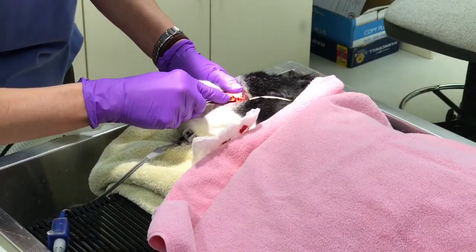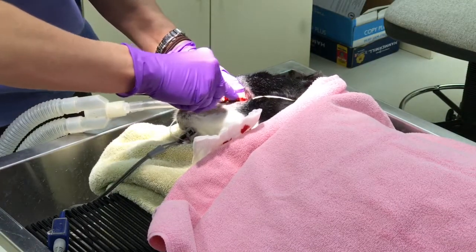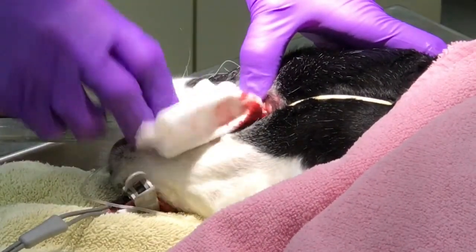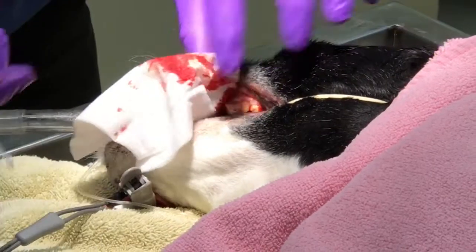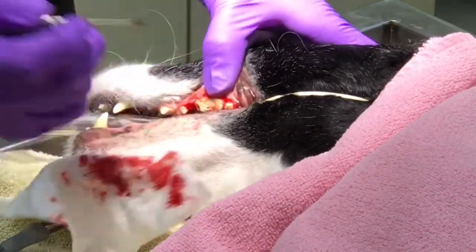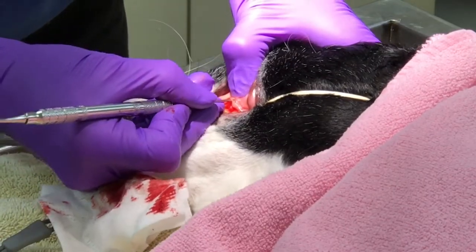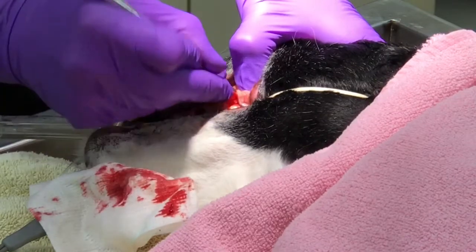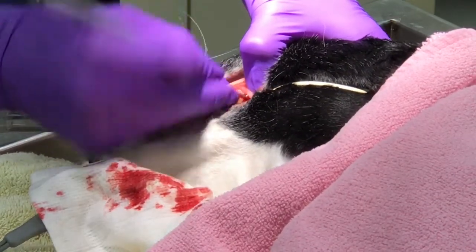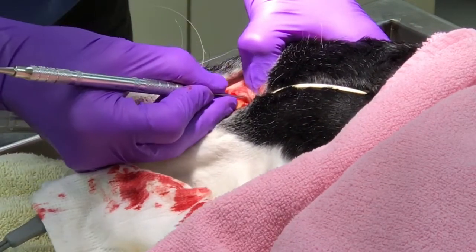Alright, so now we're going to try to elevate the flap. And since we are dealing with an oral cavity, it's considered a contaminated area, so sterility is something that cannot really be achieved in these circumstances. So we're going to simply make a gum flap so that we can have access to this tooth.